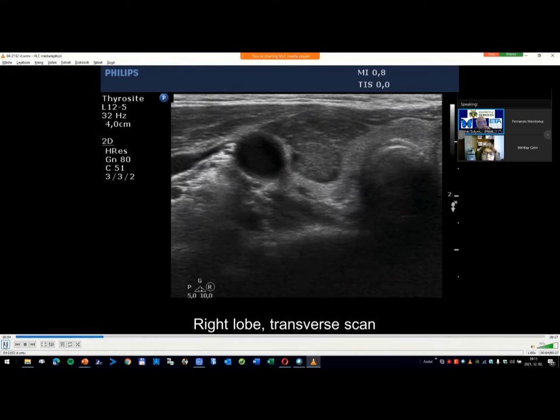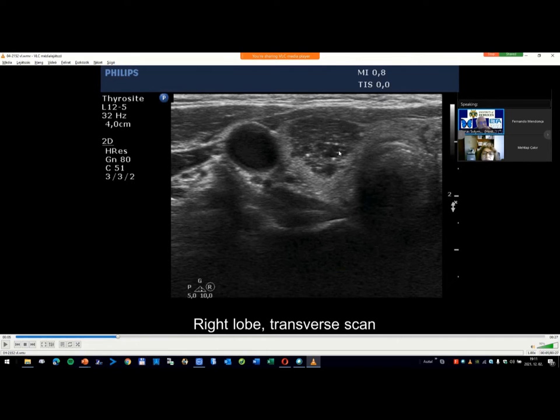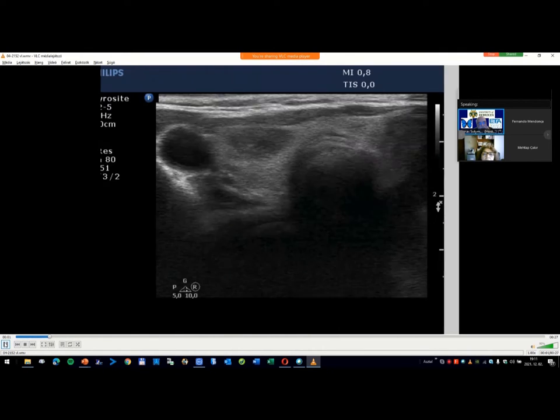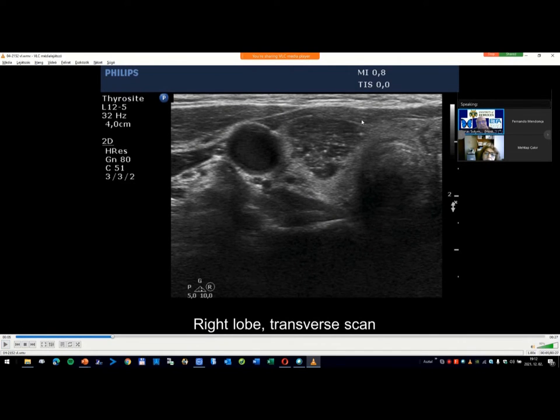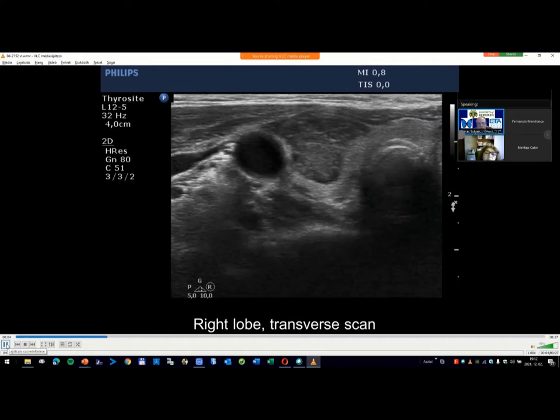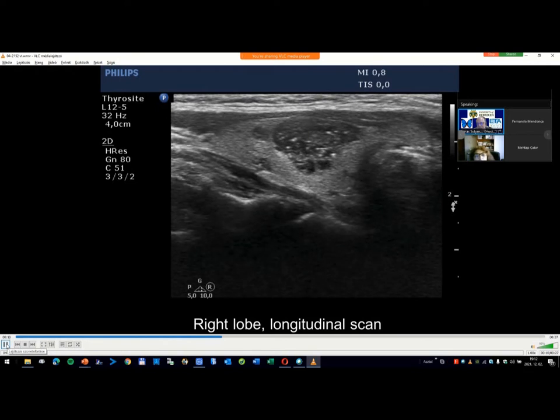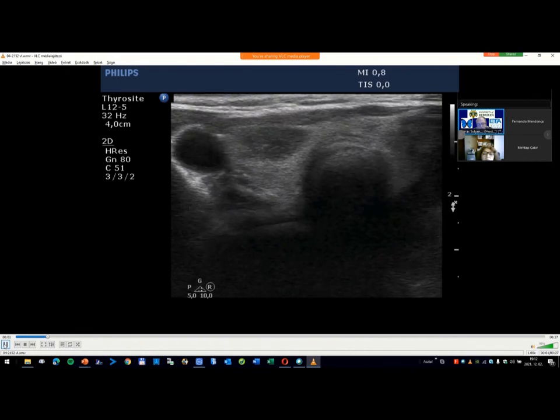I can confirm these are comet tail artifacts in this part. Within the cystic areas there are also hyperechoic spots. All these figures are related to cystic degeneration, and this pattern is quite uniformly distributed all along the nodule. Please don't misjudge these as microcalcifications — they are clearly related to cystic areas.